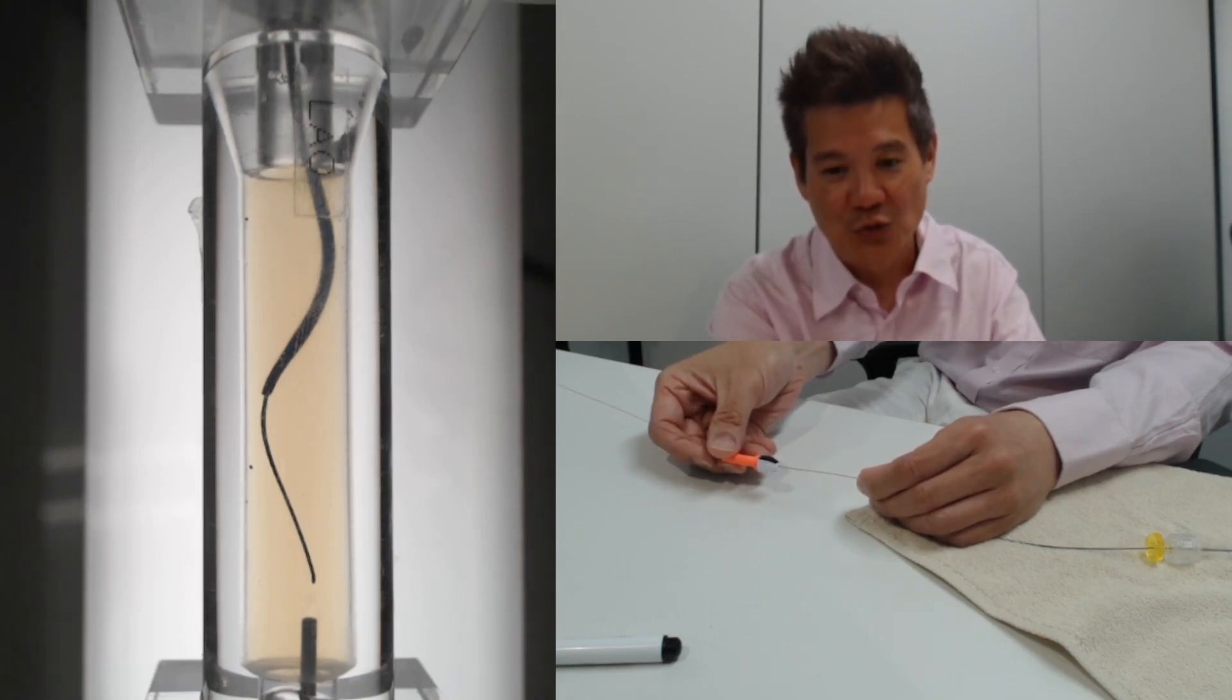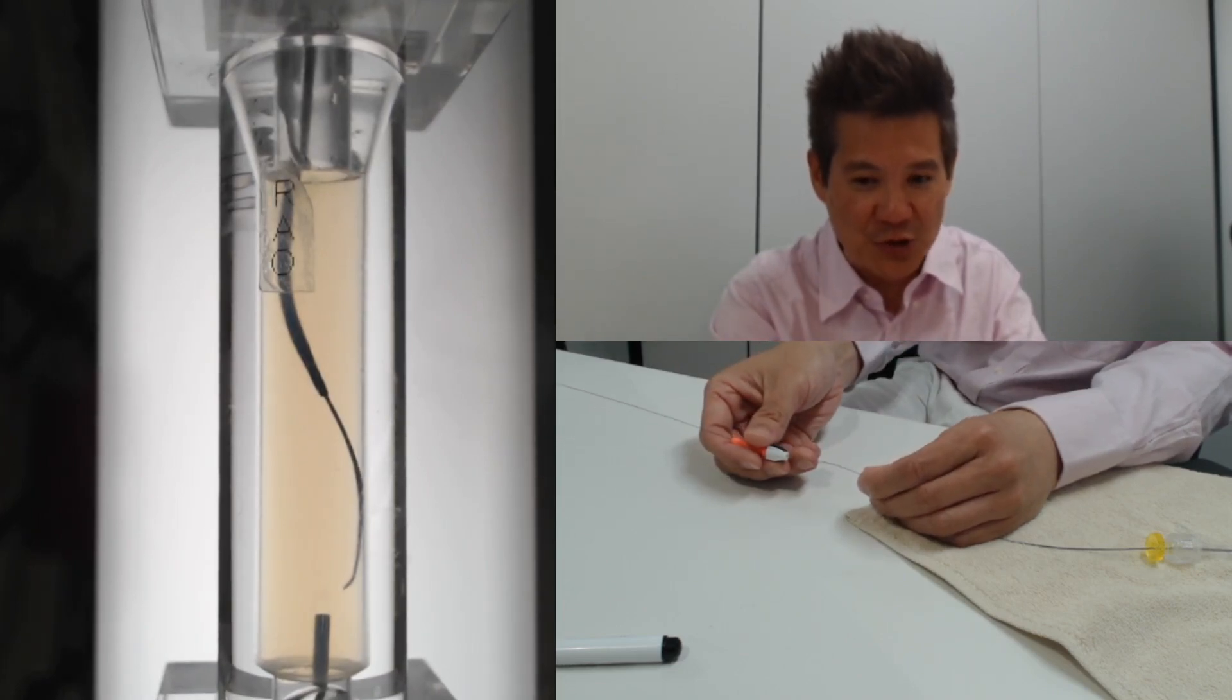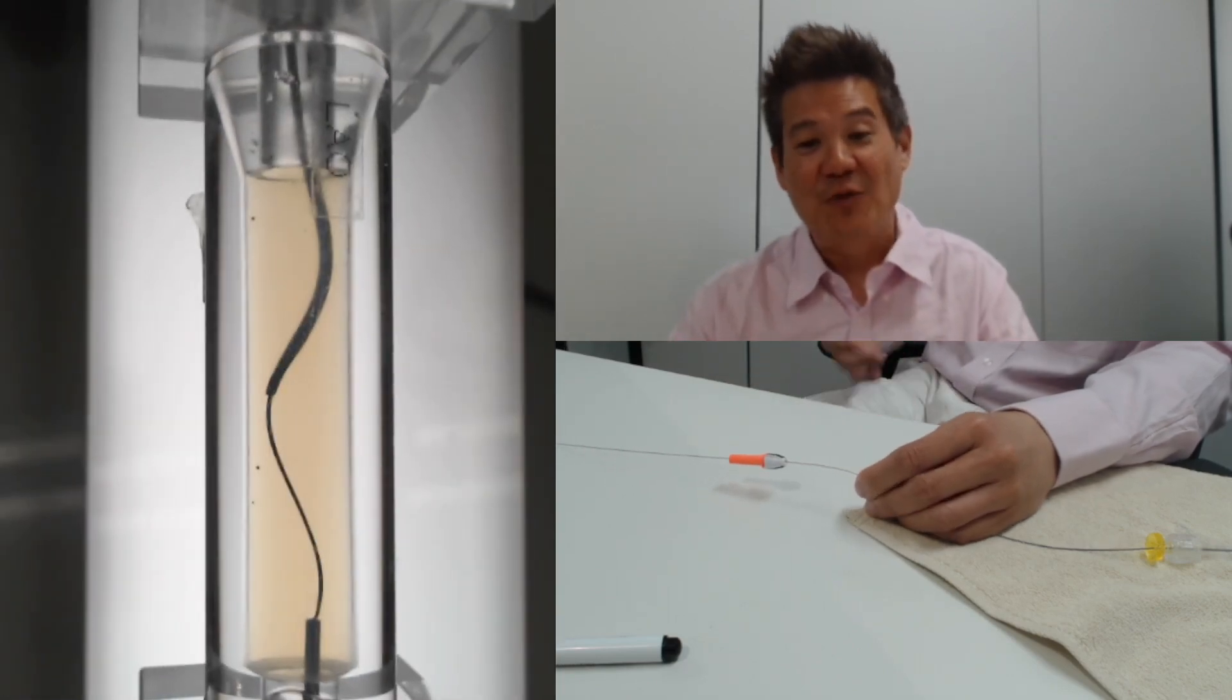In this view we don't turn anymore, we just push the wire. Then we go back to the other view and we've hit the target.